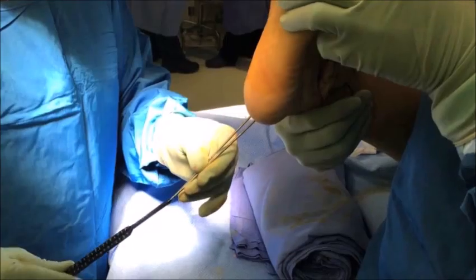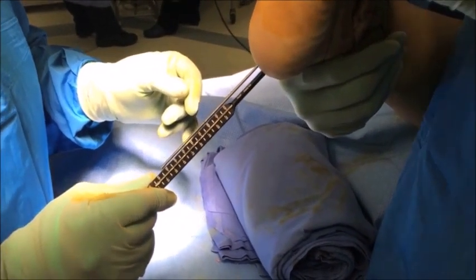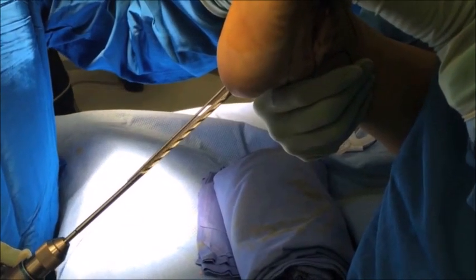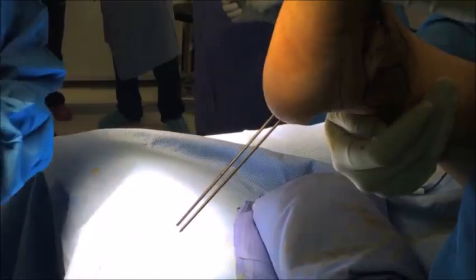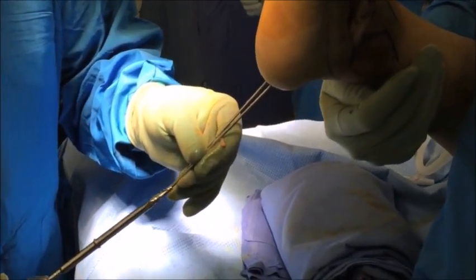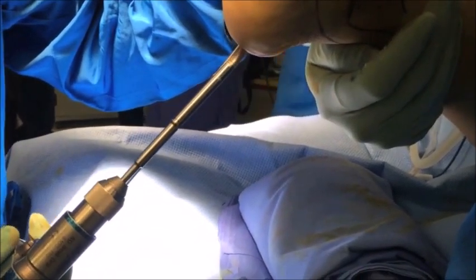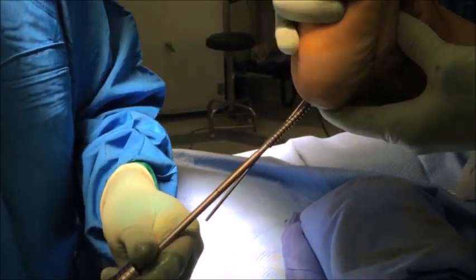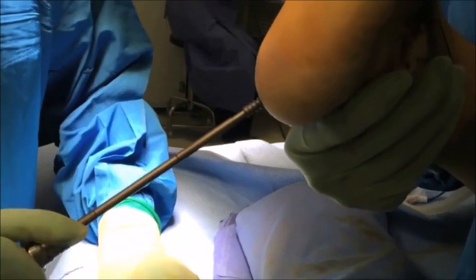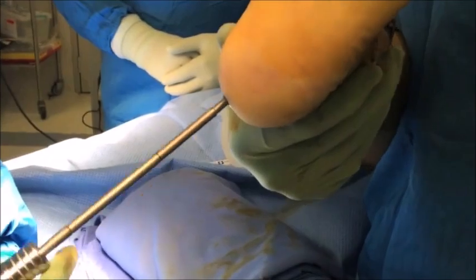Once you're happy with the reduction and placement of your K-wires, the screw lengths can be measured. It's advisable to subtract approximately five millimeters from the measured length so as not to penetrate the ankle joint. We prefer to use a 7.5 millimeter cannulated headless compression screw system so as to minimize hardware prominence, which could cause discomfort for the patient with shoe wear and impact activities. The system shown here is the Acumed Acutrack 2 7.5 headless compression screw, though any compression screw of similar size can be used.